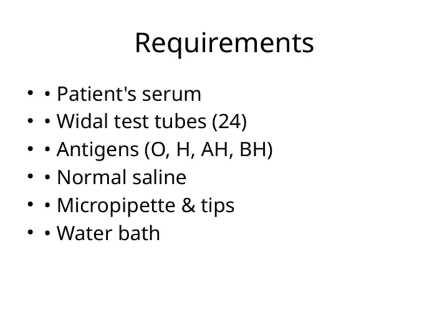Normal saline is important to dilute or prepare the reagents and samples properly. To handle small volumes accurately, we'll use a micropipette with tips, ensuring precision in our procedures. And finally, the water bath is essential to incubate the test tubes at the correct temperature, typically around 37 degrees Celsius, to facilitate the antigen-antibody reactions. All these components are integral to ensuring the test's accuracy and reliability, and they connect to the overall theme of precise diagnostic testing in microbiology.